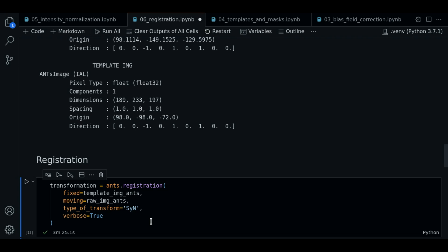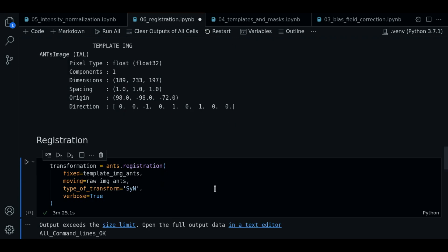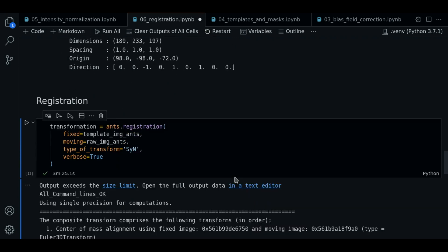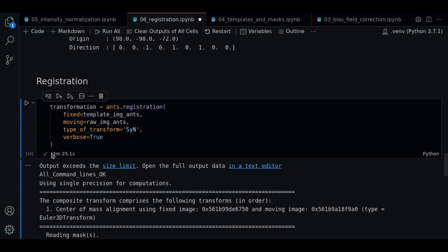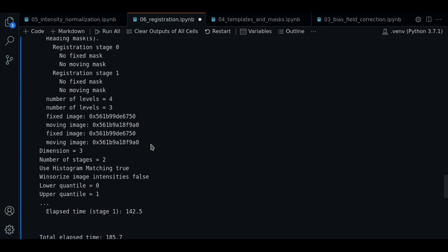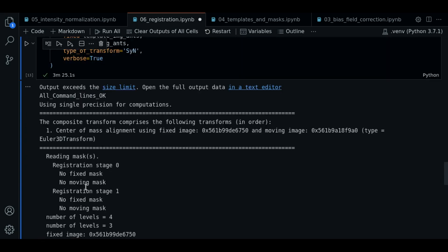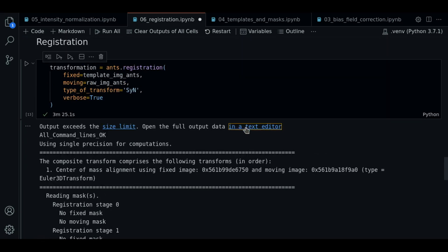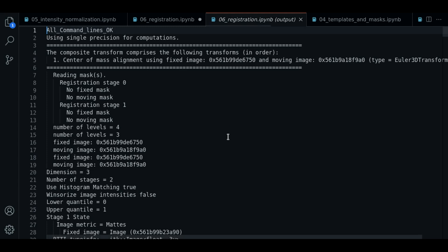So now the registration has finished. As you can see now we have some logs that have been generated. It's a bit technical. Let's review in a text editor.